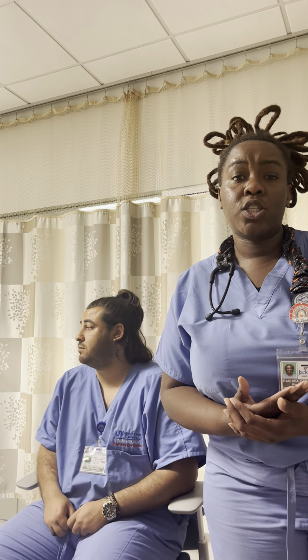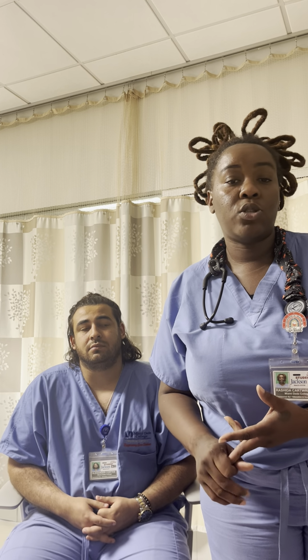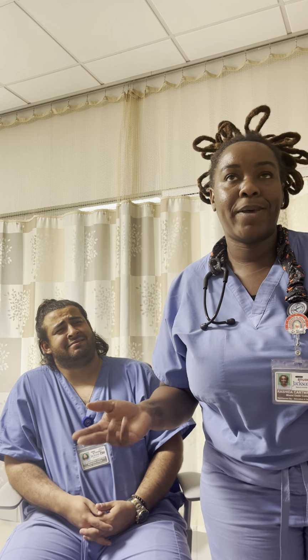Just before we start, the reasons why we would do this IS video: incentive spirometry therapy is for patients that have atelectasis or predisposing factors to atelectasis, such as upper and lower abdominal surgeries, neuromuscular disorders, surgery in COPD patients, and patients that are on prolonged bed rest.